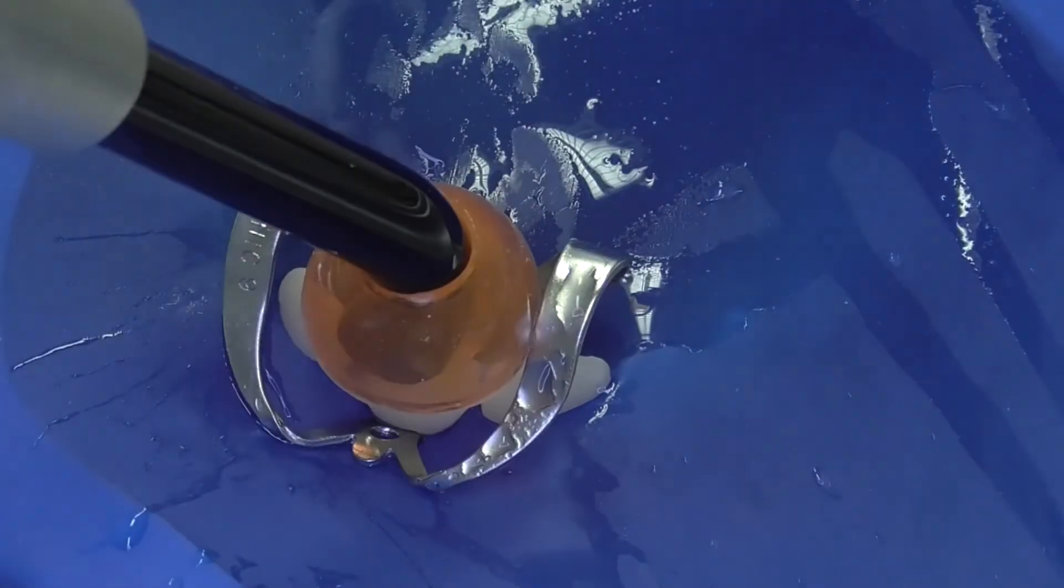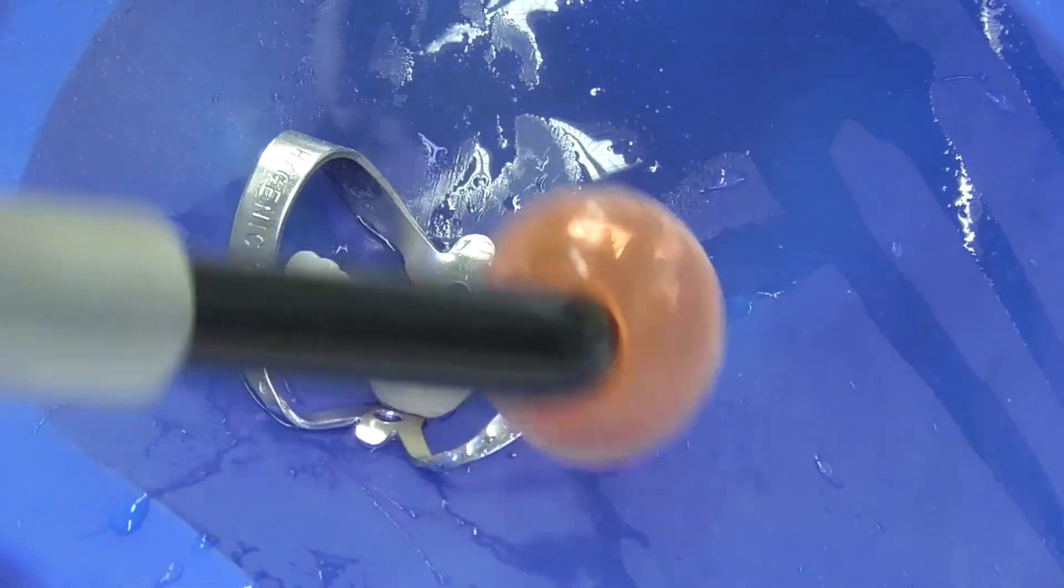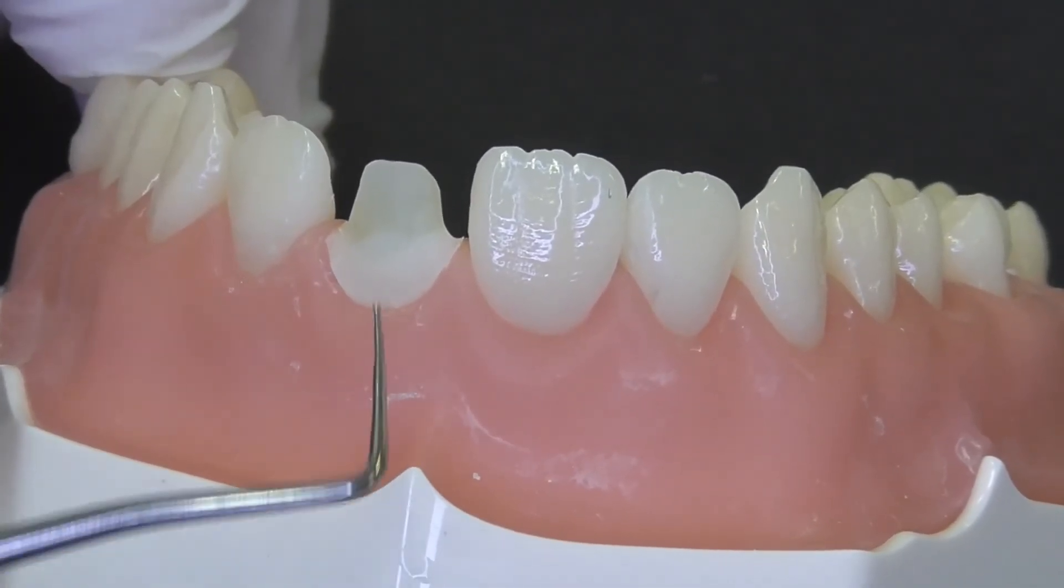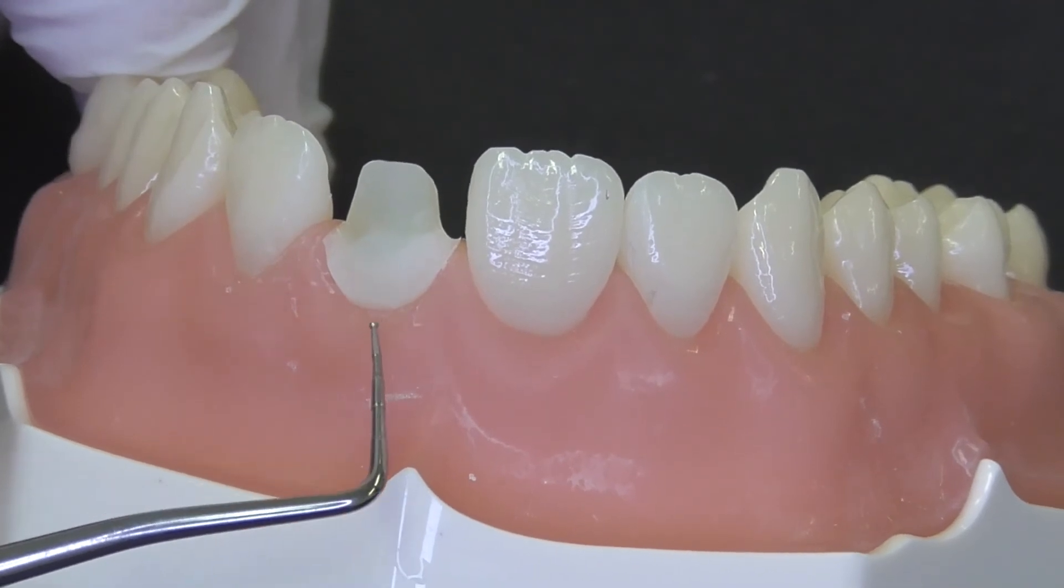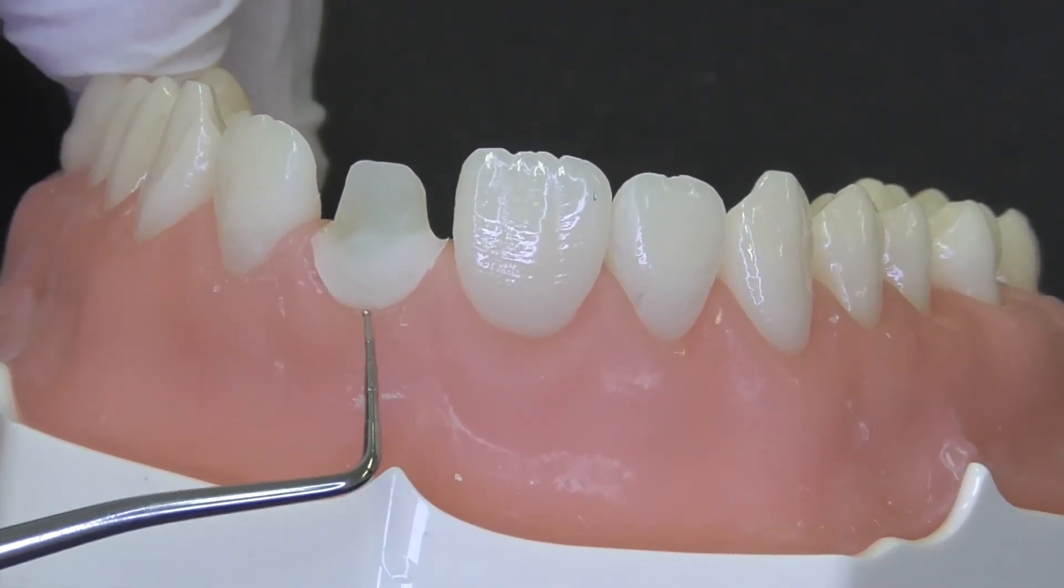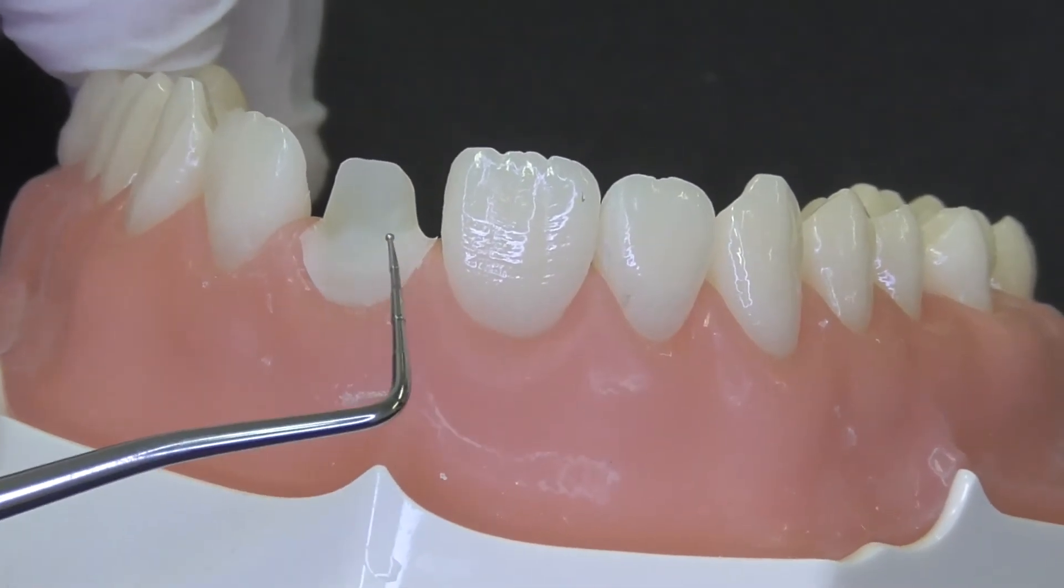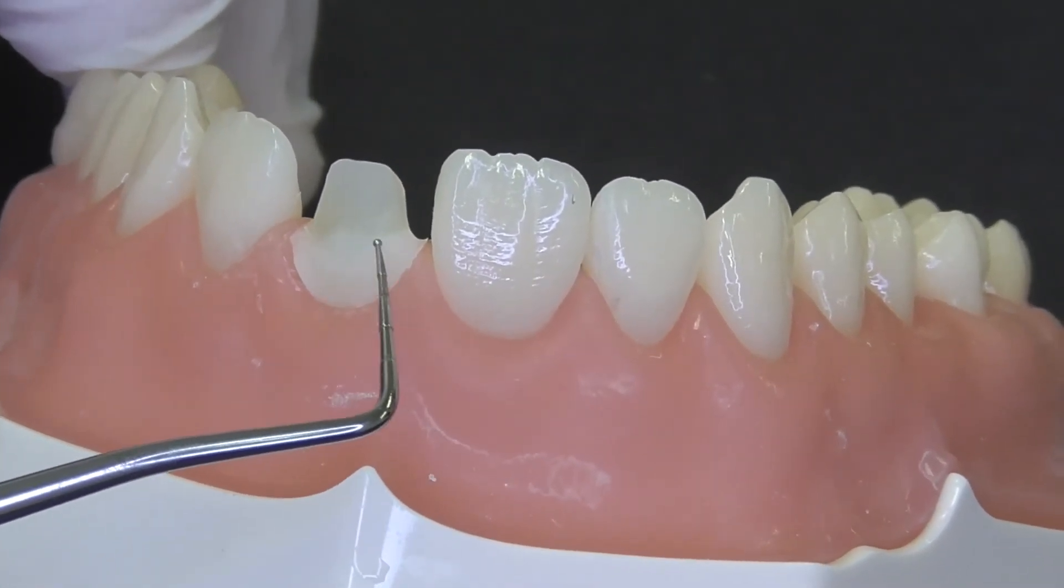After light curing and preparation of the core, we have a post-core system consisting of three pieces of longitudinal fibers embedded in the Gradia Core cementation material and the core material, which is made out of short fiber reinforced EverX Flow composite material.